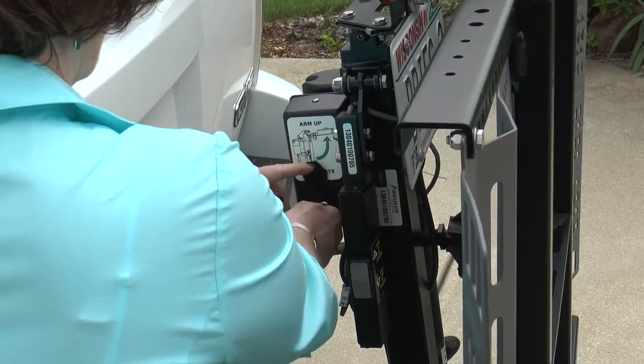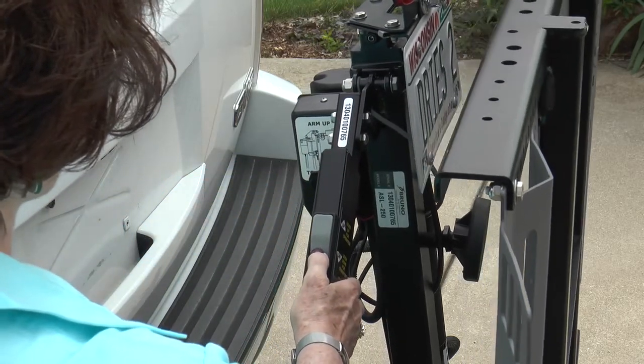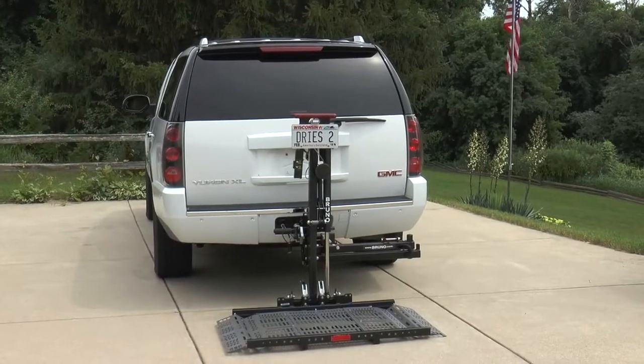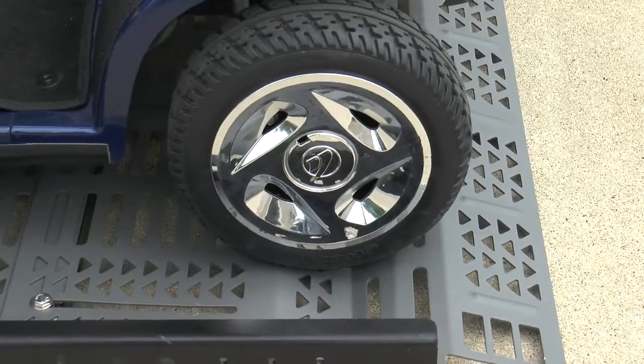Operating your Bruno Outsider is easy. Just lift the safety handle and press a button to gently lower the lift. The self-leveling platform with traction coating makes it easy to roll on or off. When the wheels gently drop into place, you're ready to raise the lift.